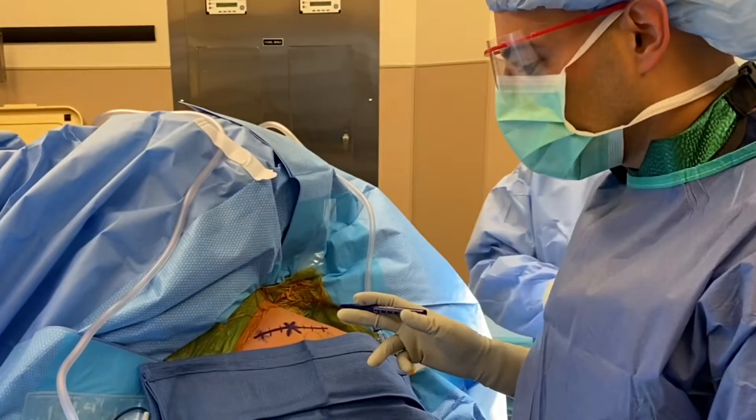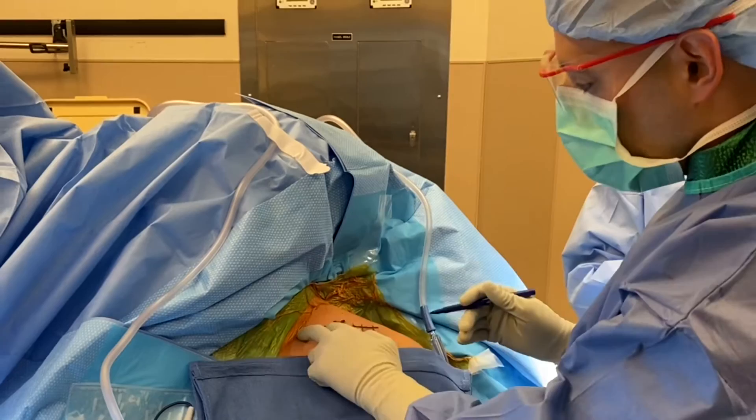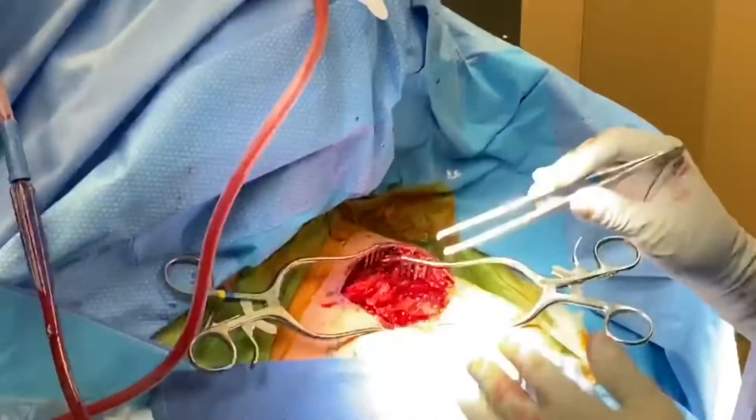Hey guys, we're here with this gentleman. He's got a very displaced mid-shaft clavicle fracture. I was palpating here right at an area where you could feel the tip of the medial clavicle going right under the skin. You could feel the lateral shaft and the medial shaft, so I just connect my line here and then that's where we're going to make our opening incision.